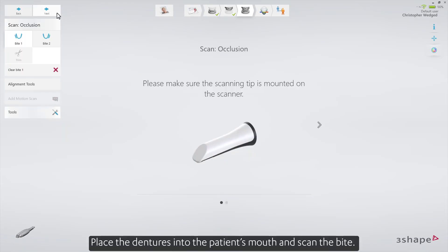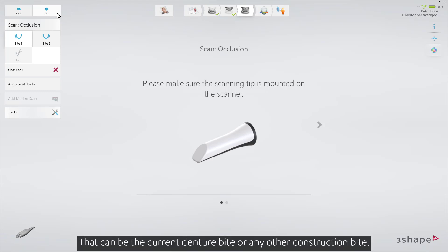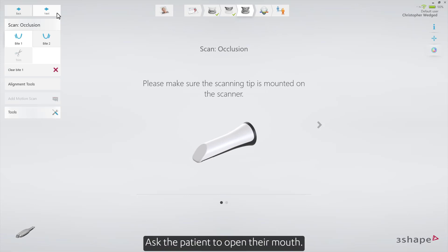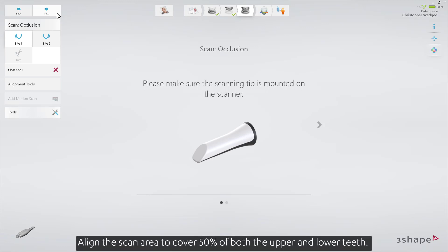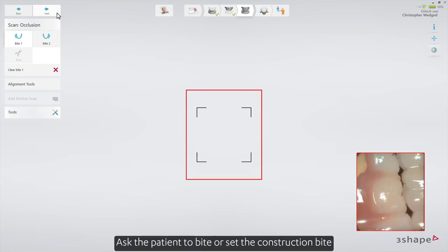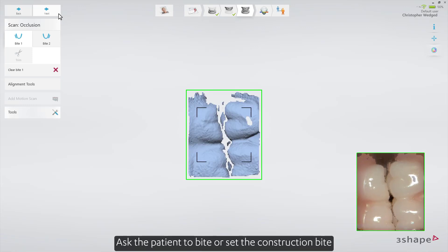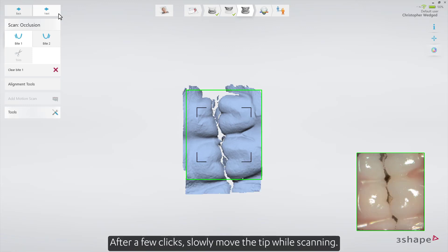Place the dentures into the patient's mouth and scan the bite. That can be the current denture bite or any other construction bite. Ask the patient to open their mouth. Position the scanner between the first and second molar on the buccal side. Align the scan area to cover 50% of both the upper and lower teeth.